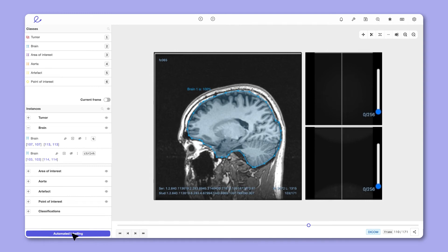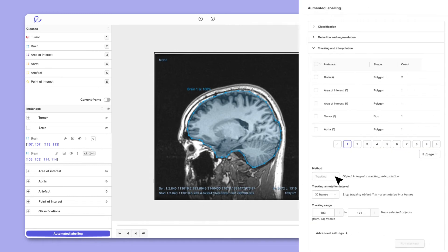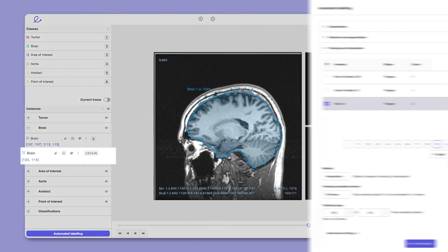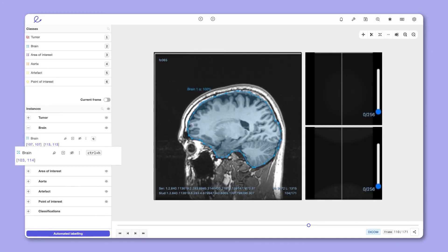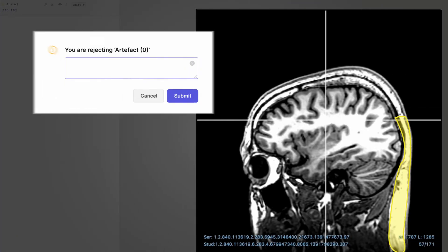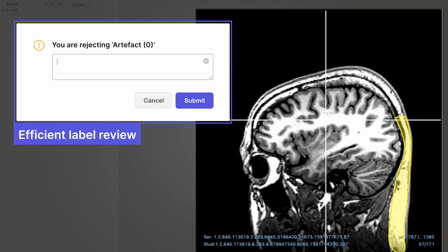Our powerful automation features can be used for generating model-produced annotations, interpolation, managing workforces, and expert review, improving accuracy and efficiency.